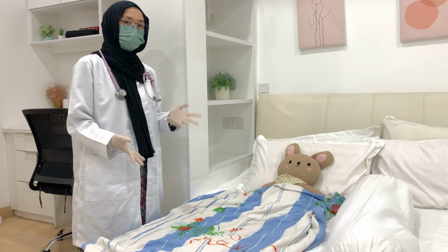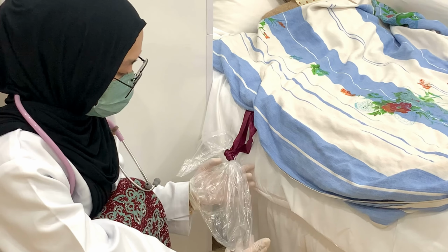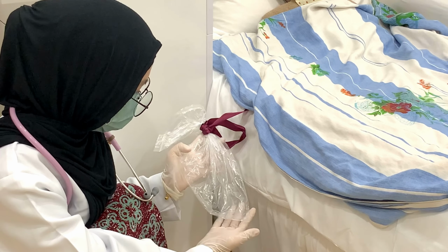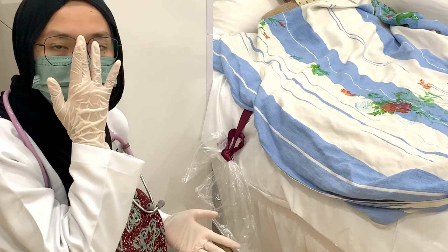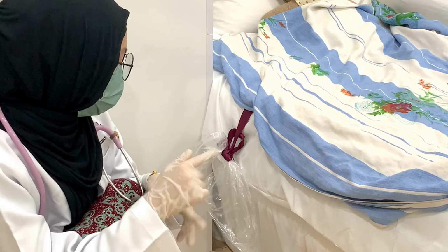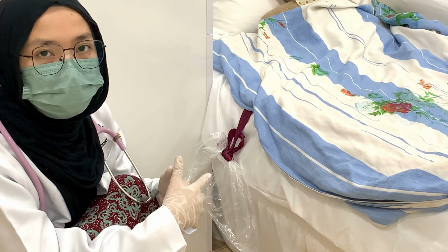And so the next thing I'm going to check is the urinary drainage bag. What I can see is the patient has not urinated in the past 24 hours, and this is a major concern, so I'm going to have to report this to the nurse. The color of the urinary output is something that I'm also supposed to check, but since the patient has not urinated in the past 24 hours, I will not be able to determine that. So I also have to inform the nurse about this.